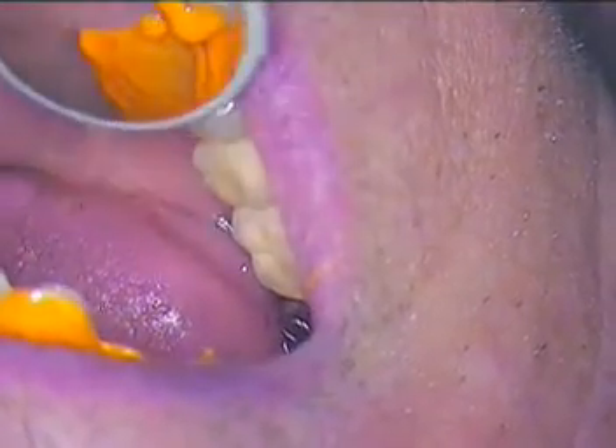Now I'm going to go ahead and seat the tray. We got lots of room. We want to try to capture a little bit of that midline, and that's it. So we're going to hold that. There we go. Luigi, we got a six minute timer set, so we're looking good.